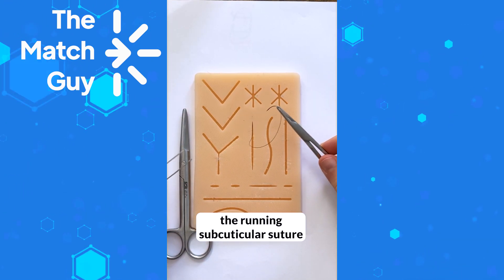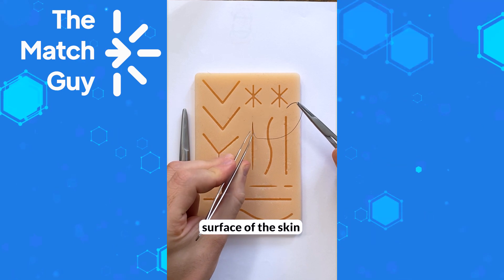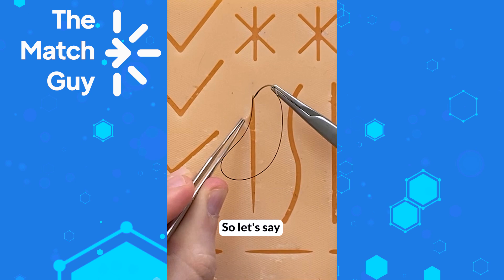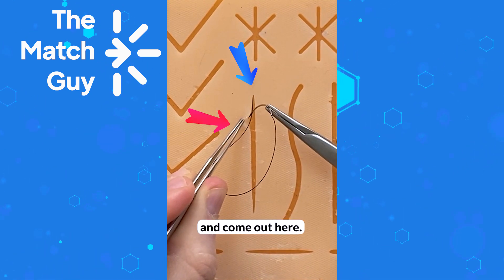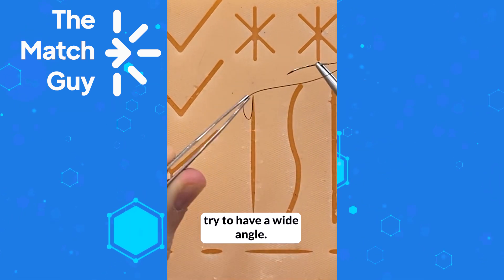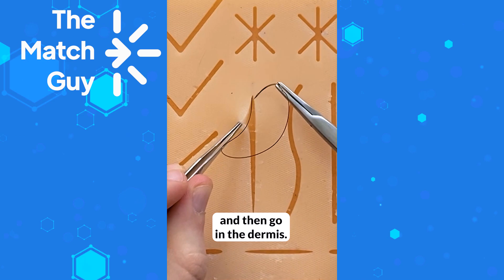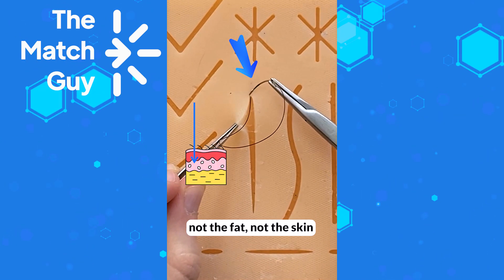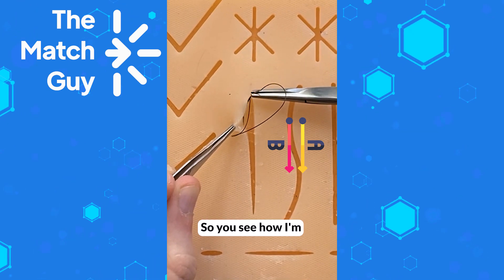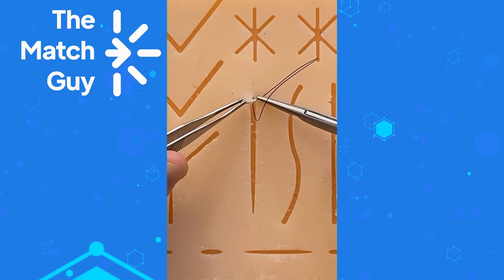Now I'm going to show you how to do the running subcuticular suture. After you tie your knot and hide it below the surface of the skin, you hold and lift the skin beyond where you want to come out. When you go in, try to have a wide angle — more than 90 degrees. Lift up the skin and then go in at the level of the dermis, not the fat and not through the skin. Then stay parallel to the skin.